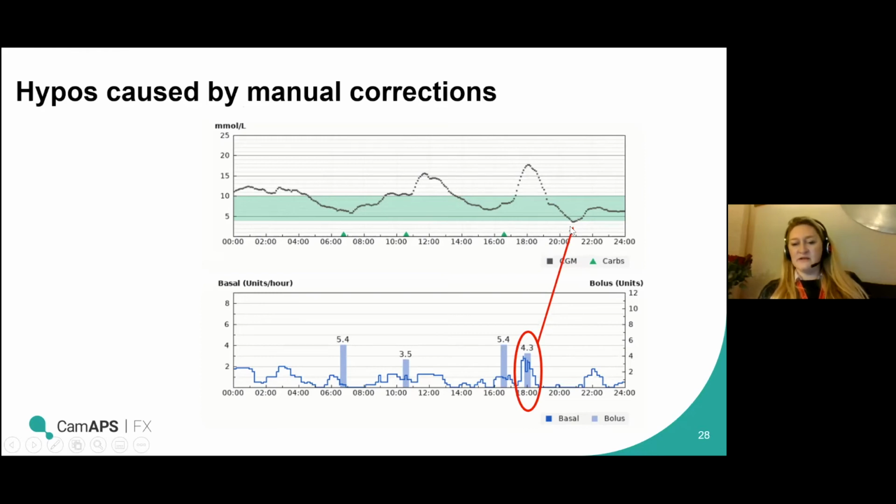And what you can also see there is after that bolus went in, the system started to deliver less and then delivered absolutely nothing apart from those little pulses that you can see that it would always have to do. But that wasn't enough, or potentially just enough to help scrape through. We don't know, potentially they might have got in with an alarm and had a bit of hypo treatment at the lowest point there, but you can see the system didn't deliver anything for a long time after that bolus went in because there was too much active insulin around.